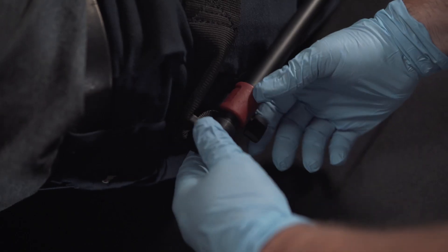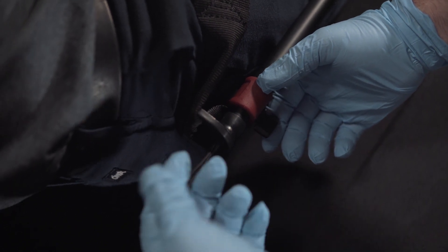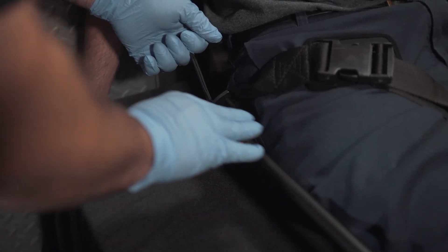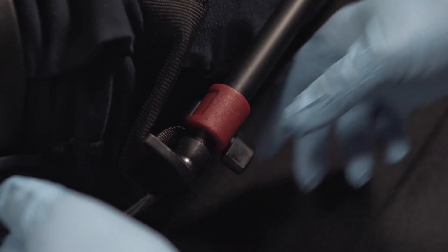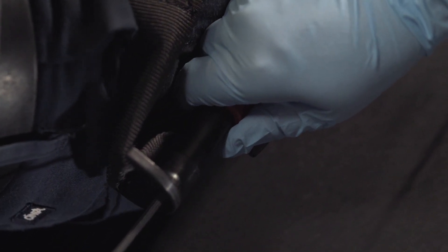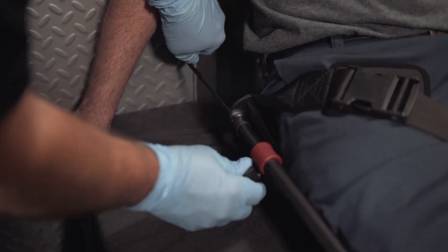Now we're going to transition up to the top screw located at the hip. This is where we're going to achieve our fine traction. There's a mechanical advantage system inside the pole that will help you achieve whatever traction you need. We're going to undo the screw, hold and pull, and that will finish off getting the traction that we need. Once that's there, we tighten this screw down, and that's going to hold it in place so we can let go.